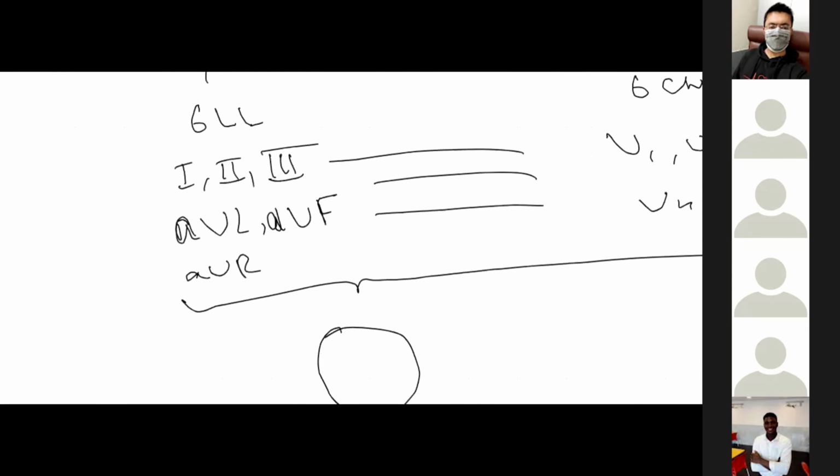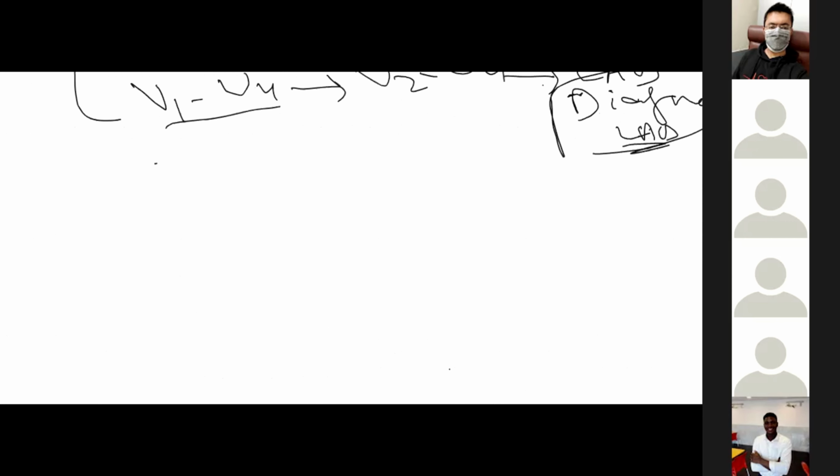So the ECG has different parts. There is an isoelectric line, then P wave, which is basically atrial depolarization. After the P wave, the first downward deflection, that is the first negative deflection, is always a Q wave.